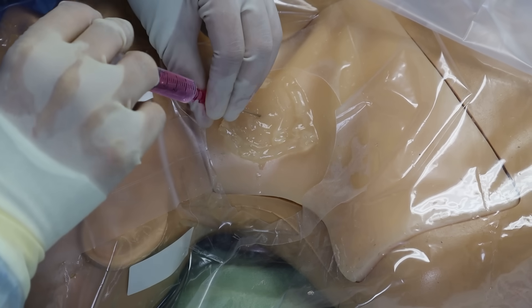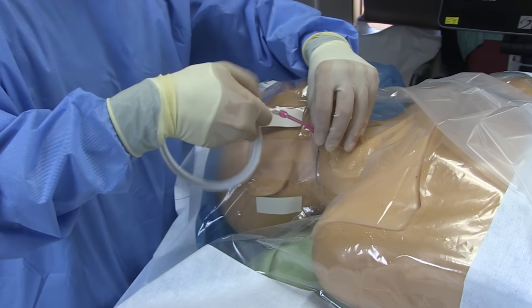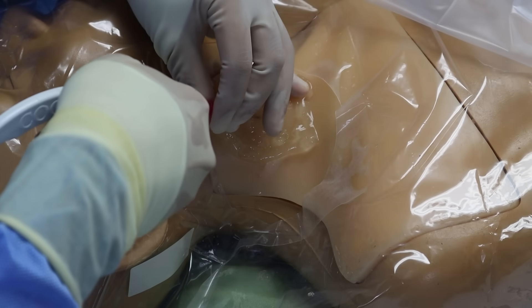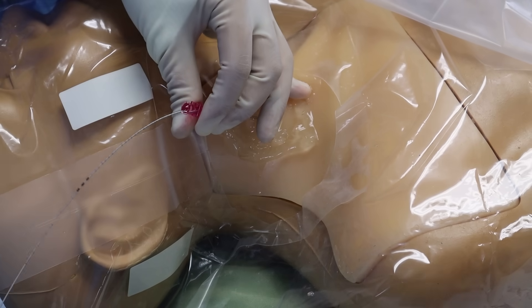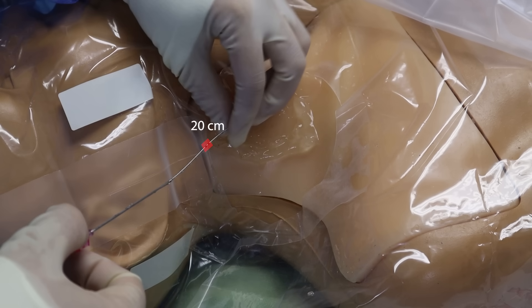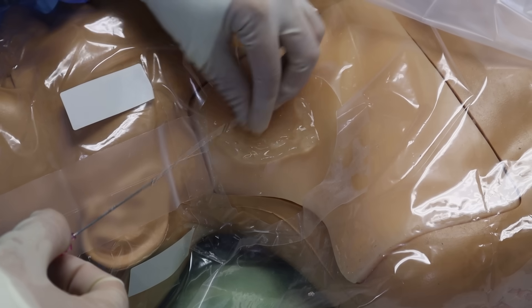If you're using the compass pressure transducer, you can feed a wire through it so you don't have to remove the syringe. Now grab that wire and start feeding it through the needle. The wire should advance fairly smoothly — if it does not, something is wrong, and you should stop and reassess. You only need to feed as much wire as the catheter is long. The second or two line marking on the wire identifies 20 cm, so advance until that mark is at the skin. As you advance, watch the monitors for signs of ectopy. If you see that, you are too deep and should withdraw the wire a couple centimeters.